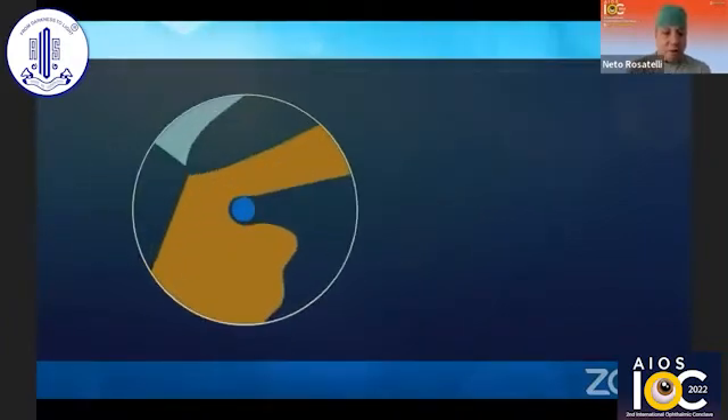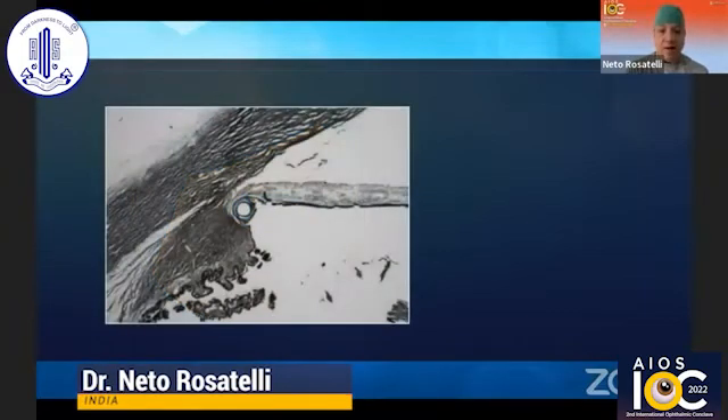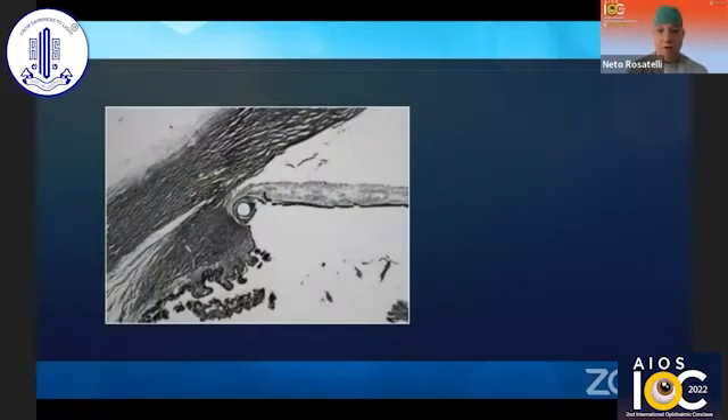An important detail regarding IOL haptic placement: after a few weeks, some fibrotic tissue is formed and the haptic becomes deeply embedded in the ciliary sulcus. So we do not need the suture anymore to sustain the IOL in place. There is no concern of future suture degradation, as the IOL is securely placed in the sulcus.